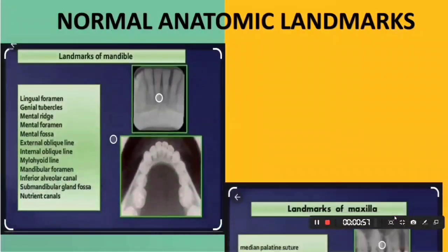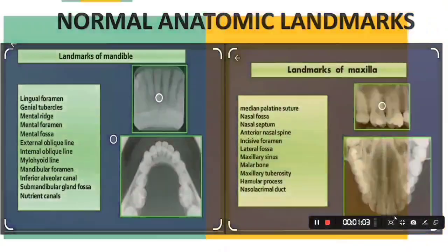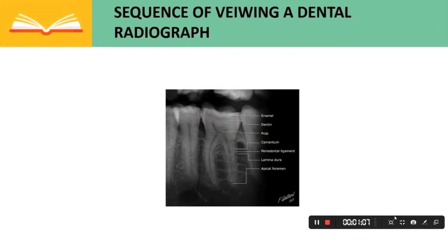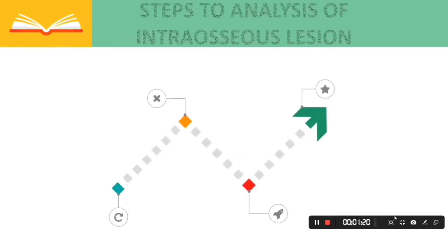Here are some normal anatomic landmarks seen on radiographs of the maxilla and mandible. Sequence of viewing a dental radiograph: first, assess the periphery and corners of the image; second, examine the bone pattern of the maxilla and mandible; third, examine the teeth.